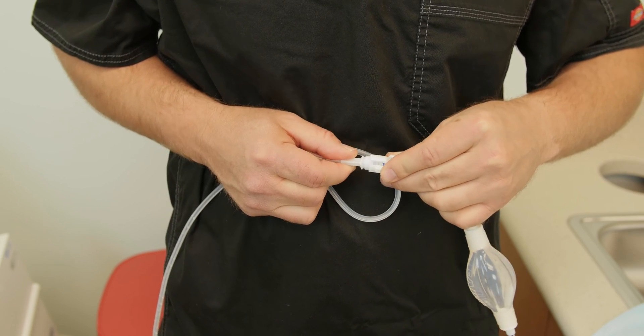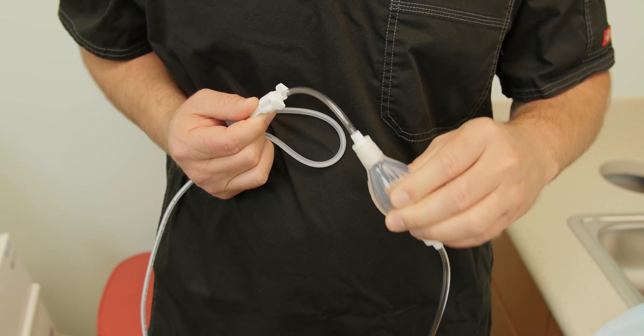The other end of the catheter has a valve. When you connect the Aspera drainage bag to the catheter, the valve opens. When you squeeze the pump on the Aspera drainage bag, fluid will start to drain from the peritoneal space in your abdomen or the pleural space in your chest and fill the drainage bag.